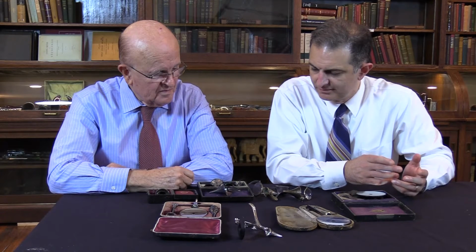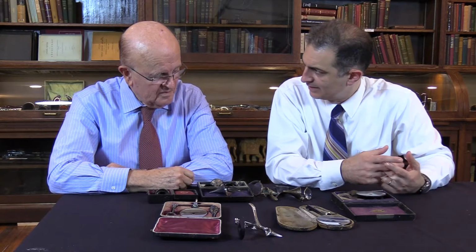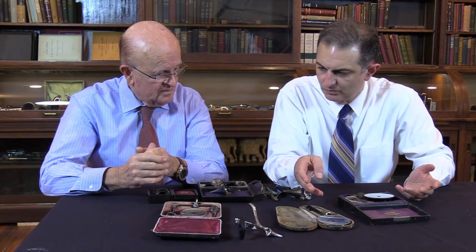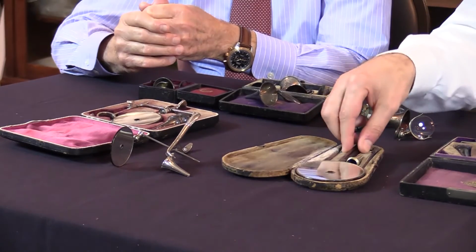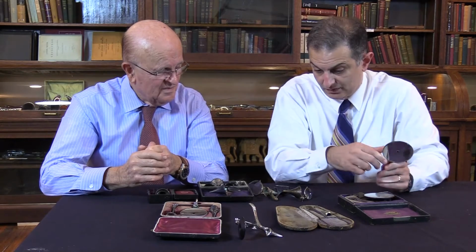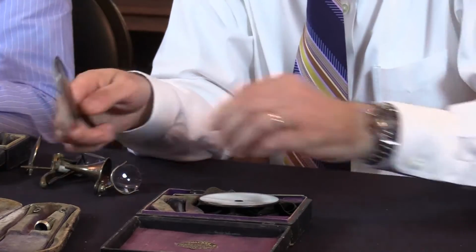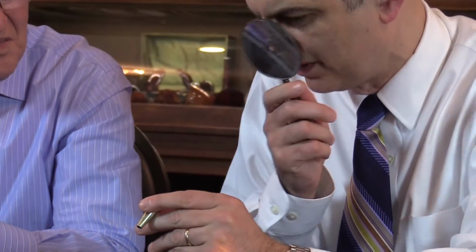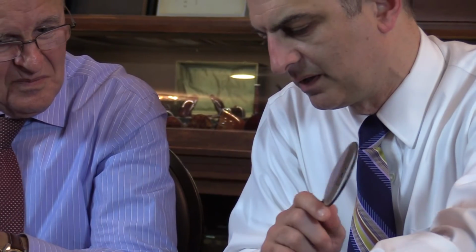So now we really have to focus our attention on how we get light into these ears. And before we really had an electrical source for light, we used mirrors. And even to this day, some of us still prefer head mirrors when we're examining the oral cavity or pharynx or the nose. But back in the old days, you'd gather your light through a mirror to look in the ears. And so with this simple device, you'd have basically a handheld head mirror, and look through the opening and focus the beam of light through the speculum.